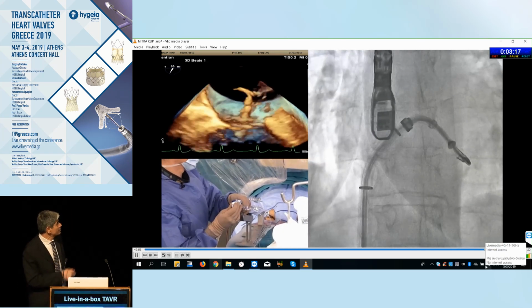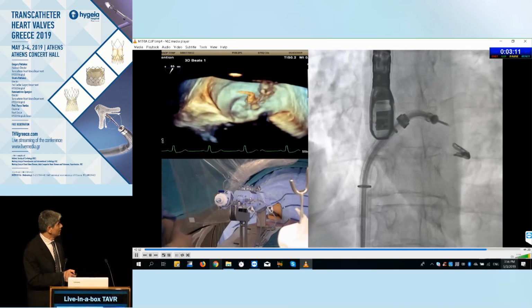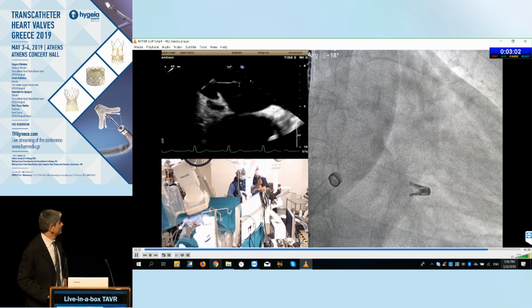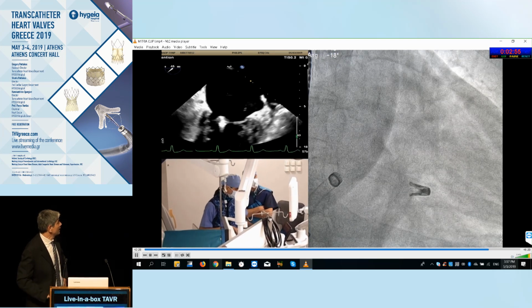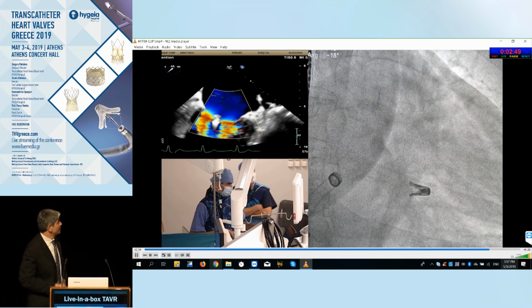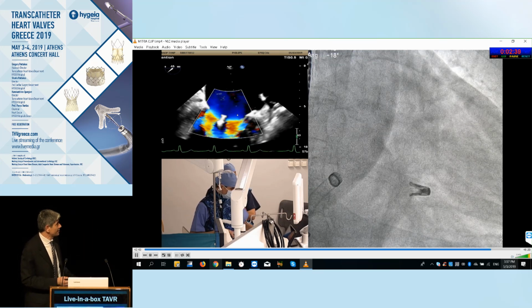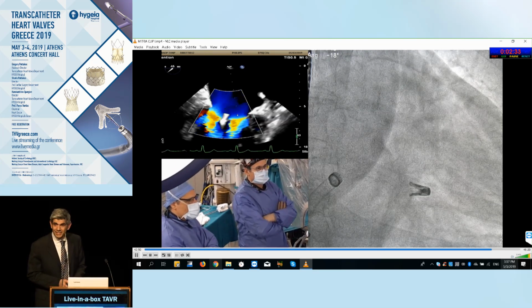And concluding the procedure, this is the release phase of the procedure. And we evaluate the color once more and whether anything has changed. Very stable position for the device, and final evaluation of color. Here we've removed the clip delivery system, and a small jet from either side, very clinically insignificant jets, we would say. The procedure essentially concluded with removing the steerable guide catheter and had no complications. And with this, this is the case that we presented.